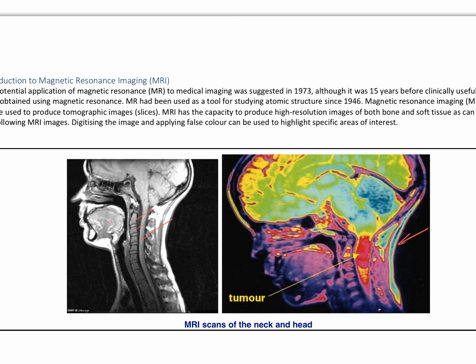Like CAT scans, MRIs show slices through the body. The images are tomographic, or tomography. And as I said, they can show both soft tissues and bone. The MRI is the highest quality image that we have, and it's produced from within the body.